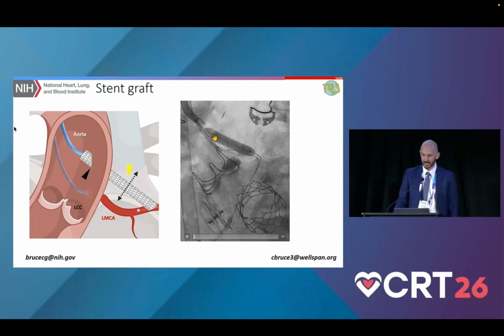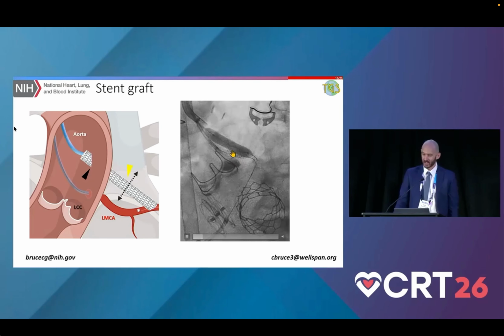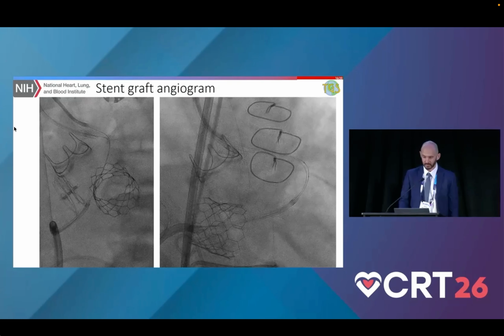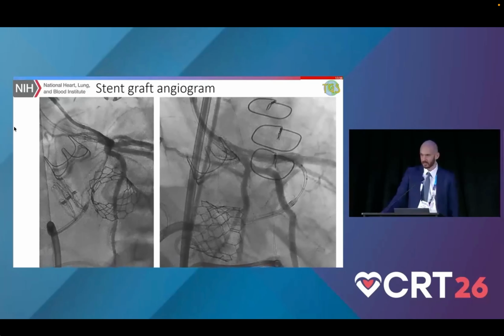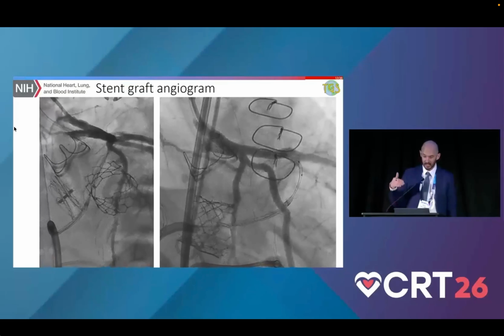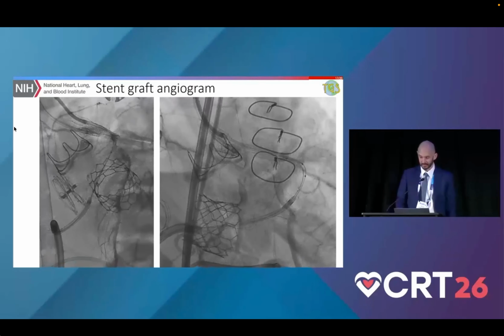But you can see that it extends from aortic exit, proximal anastomosis, to the distal anastomosis. And the stent that was pre-positioned for our stent and stingray technique just gets crushed out of the way. And that section between left main ostium and the stent graft is going to be redundant afterwards because there's going to be occlusion. So this is now, after stent delivery, an angiogram down the newly positioned stent graft. So you can see brisk TIMI 3 flow into all of the left-sided vessels through that stent graft. It extends from the aorta, and there's no reflux or leak around the stent.